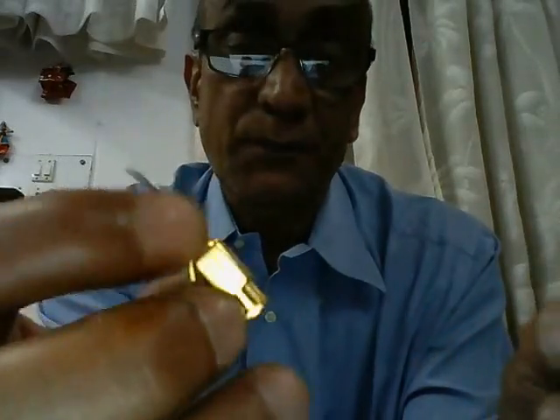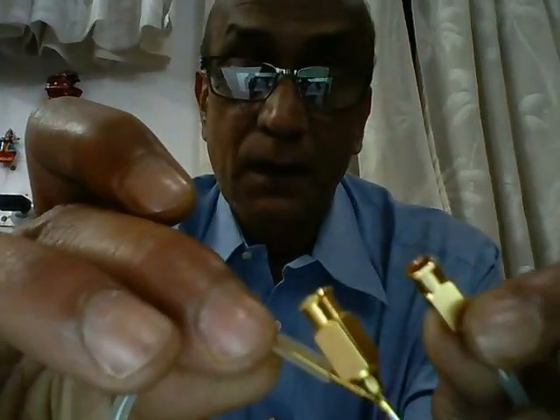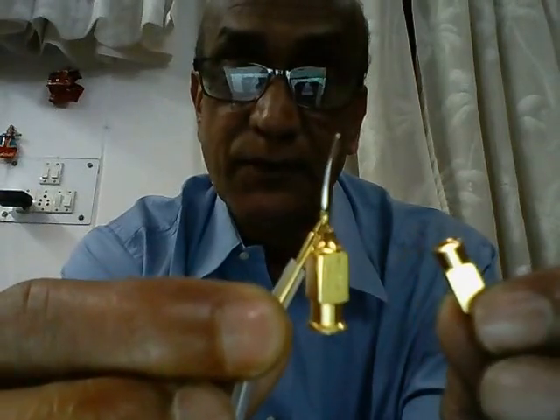Now comes the question: which of these two hubs do we use for aspiration and which do we use for irrigation? There is something called a direct Simcoe and a reverse Simcoe. Let's take the direct Simcoe first.